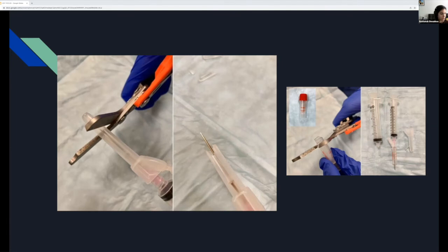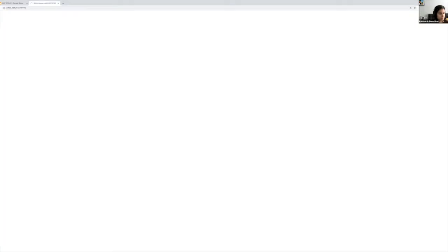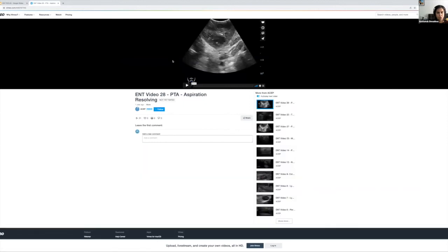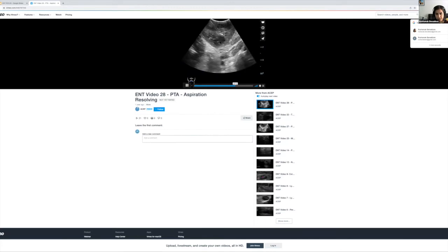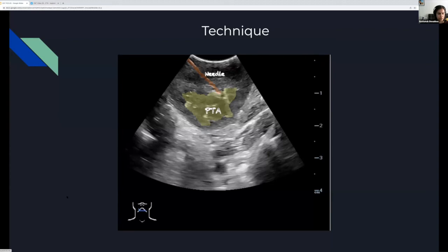If you decide to do it under ultrasound guidance, you can see your needle going in and see the abscess being aspirated. You can see the needle tip, and as the person is aspirating, the size of the abscess gets smaller. It's a nice visualization that confirms you're in the right place and aspirating the pus out — you can actually watch the size getting smaller.